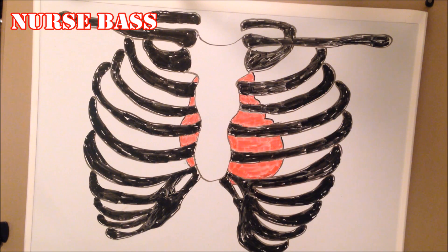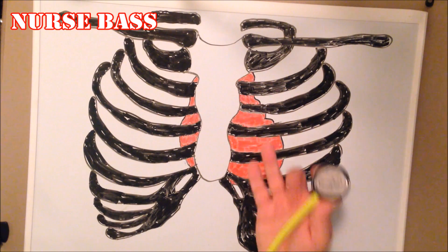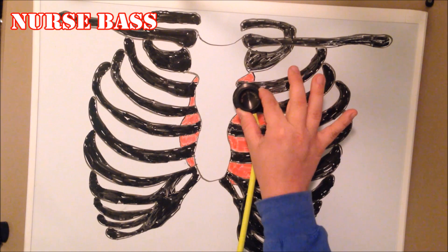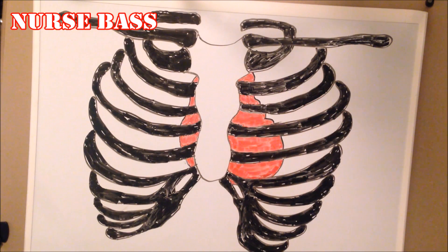Next is Erb's point — the E. It is the left sternal border, third intercostal space. So from Pulmonic, you simply go down one intercostal space to get to Erb's point.